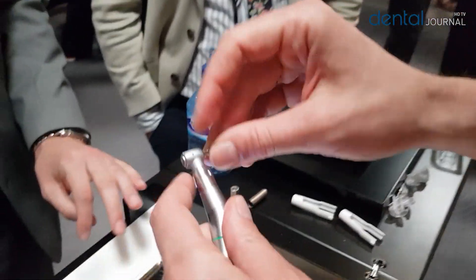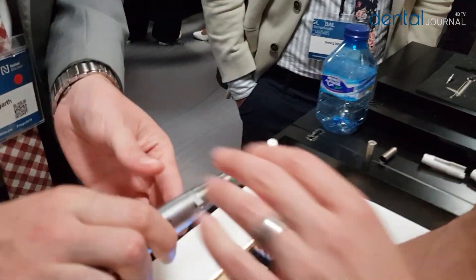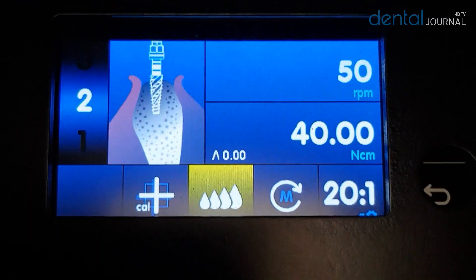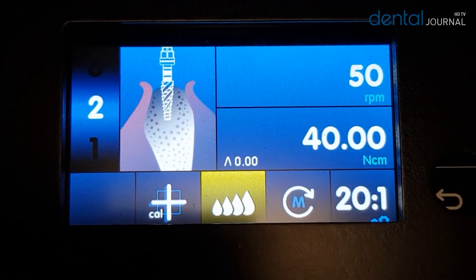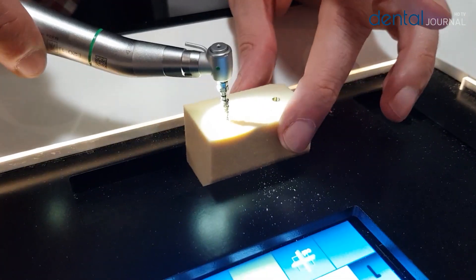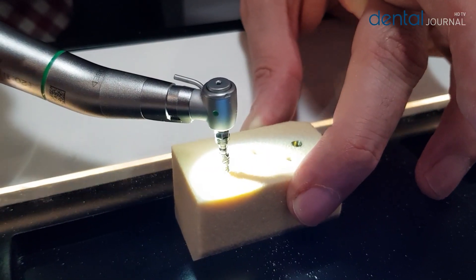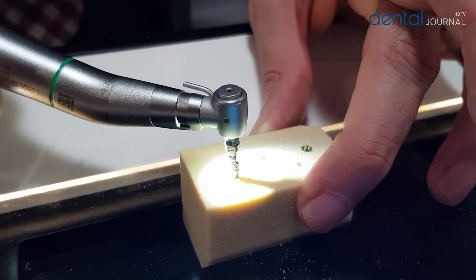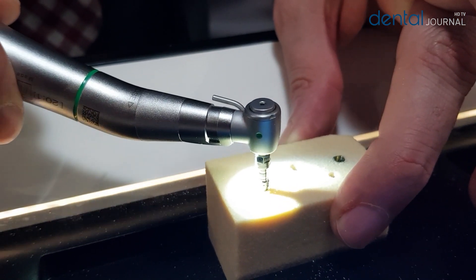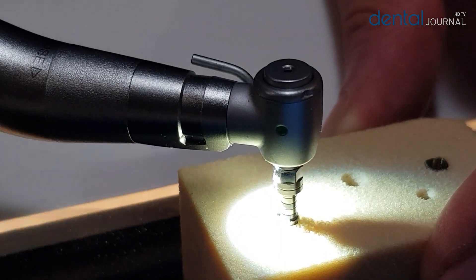It is called the Oseo Shaper, and the Oseo Shaper runs only at 50 RPM. It's very slow, and Nobel Biocare says it generates less heat and more bone chips, and also leaves more bone chips in the hole. So the osseo-integration should be faster and better compared to conventional drilling processes.